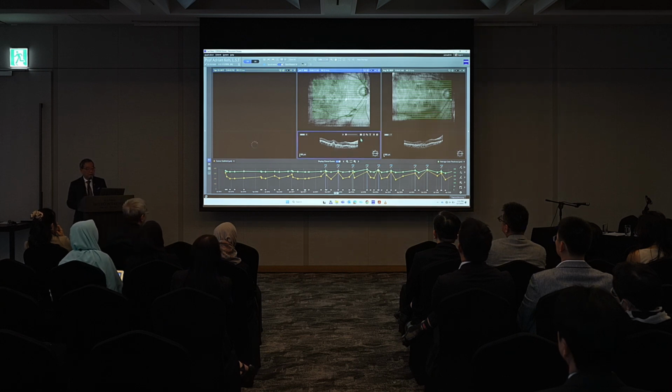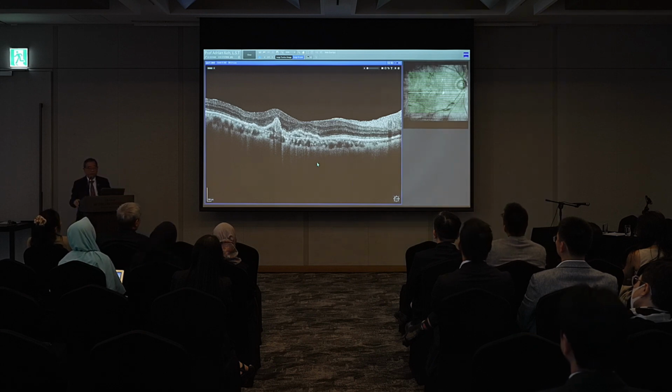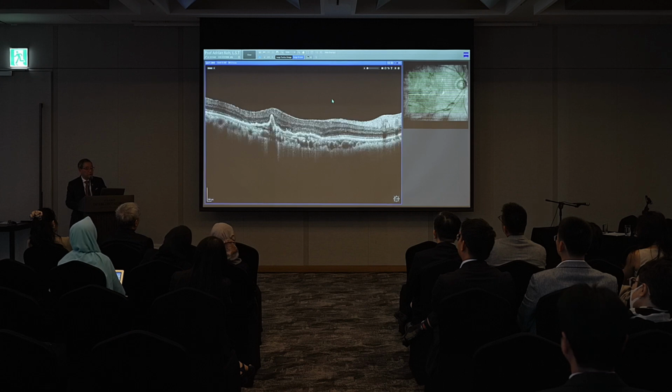Because we are then able to pull up this image as rasters. I mentioned earlier in the morning that looking at a macular OCT is good from a broad perspective, maybe from a quantitative perspective, but very often we want to look at individual raster scans for detail. And this allows us to very, very quickly pull up that particular visit and look at the detailed images at will. Right? And so this is a patient who has responded to Eylea treatment.